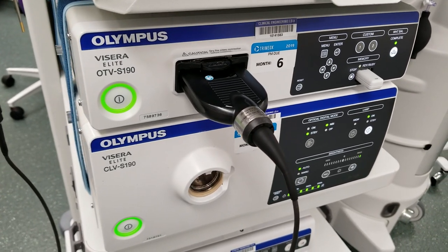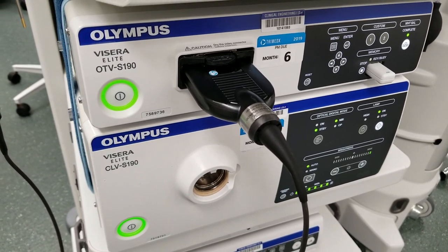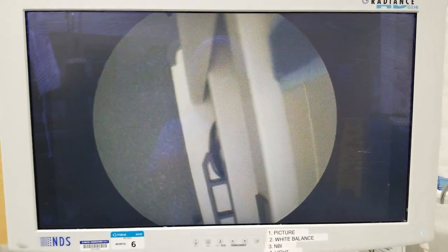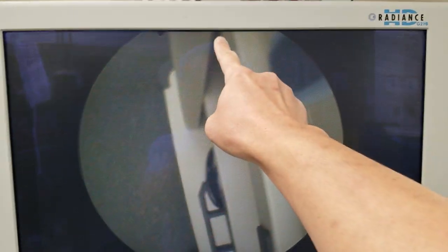If your operating room has one of these beautiful Olympus setups — the S190 systems — however, you are frustrated with this image quality. What is wrong with this picture? Look at the top and bottom: cut off. This is despite having the technician who set up the system and my Olympus rep come in here to try to fix it. Despite their efforts, they were unsuccessful.